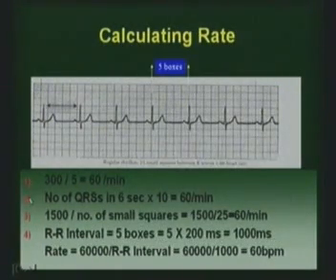As I have shown here, we have the number of QRSs in 6 seconds. On the traditional ECG graphs, at the end of every 3 seconds, we have a line going onto the white border. If you can see it here, we have this going across, and after 1, 2 and 3 we have another line here, then 1, 2 and 3 we have another line here. So every 3 seconds we'll have a line which is extended. So it's not a misprint. Okay, so this is 3 seconds.